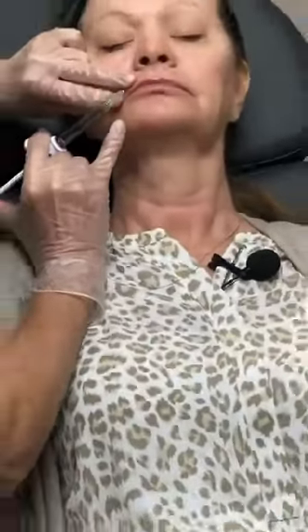Okay, you ready? And we do feel the lippies a little bit more. Okay, open just a touch for me. There you go. Good. And again, she has a little bit of numbing on. That numbing works pretty darn well. And you can already see just that little bit of a point. Then go ahead and close. Can you see, it's a teeny bit, but you can see just that little bit of definition over that side. I don't even think that was 1 cc. It's just a teeny tiny amount.